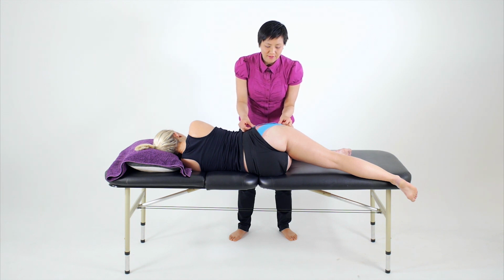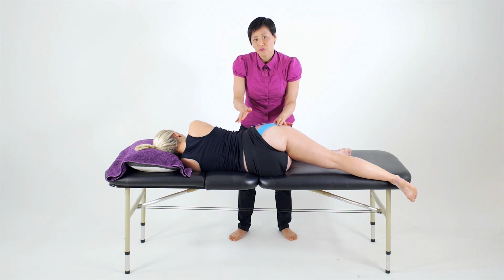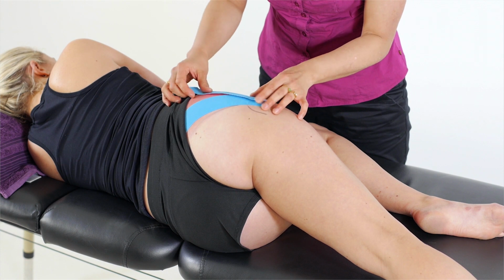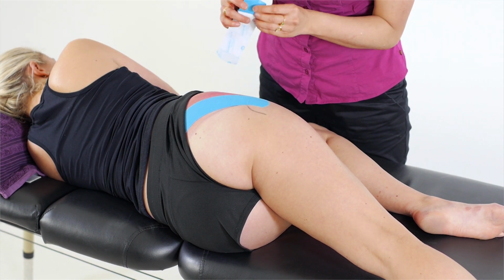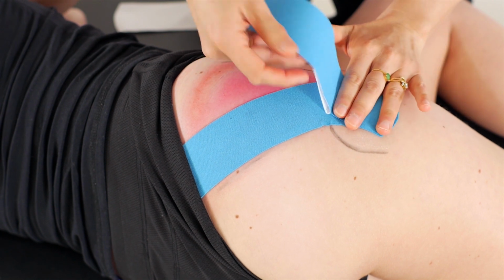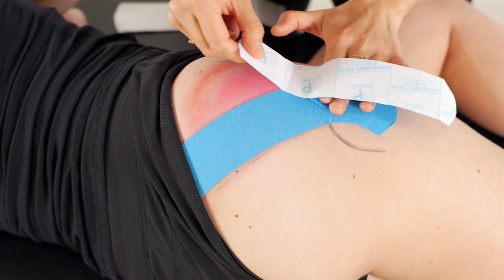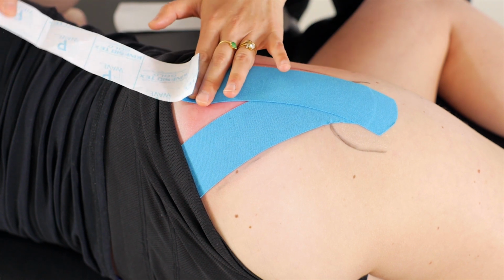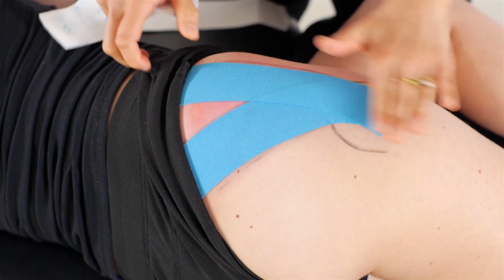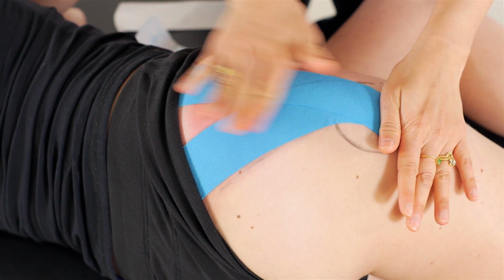From here, we measure a length of tape from the greater trochanter to the iliac spine, more anteriorly here. And this will cover both the gluteus medius, which attaches into the iliac spine, as well as the gluteus minimus that actually sits underneath it. We'll take the tape, roll it off the backing, set it to 0% tension there, and place that anchor on the greater trochanter. From here, we roll the tape off the backing with 15 to 25% stretch before letting the final anchor settle to 0, and then rubbing that onto the iliac crest.